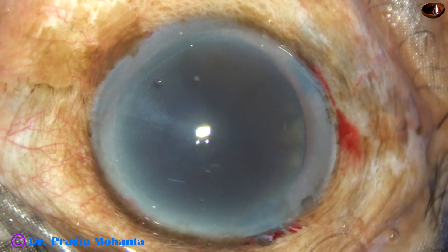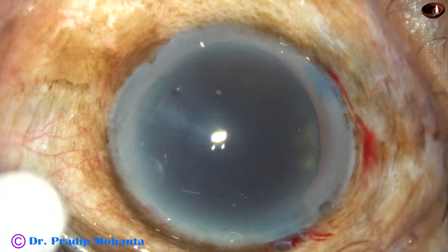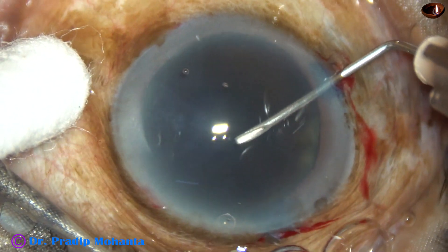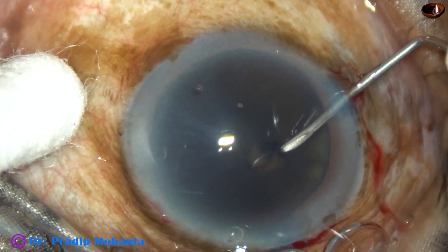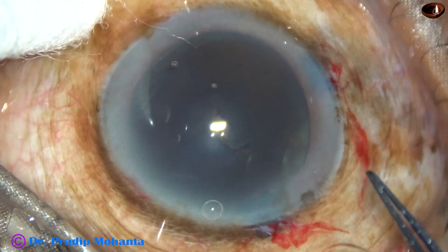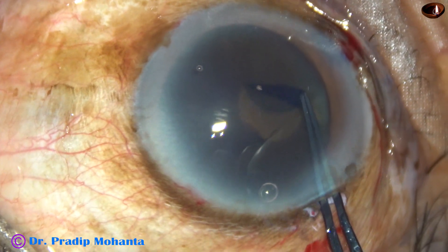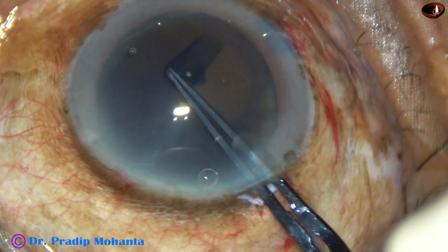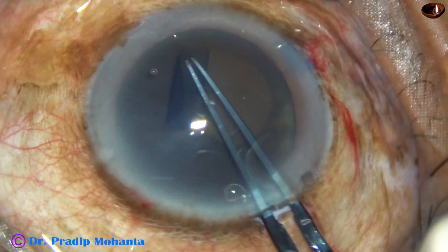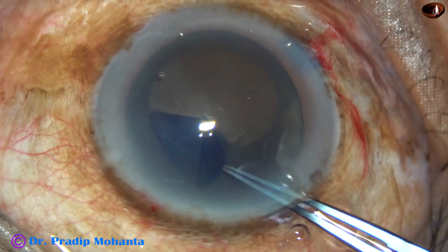And now, it's time to do the capsulorrhexis. We have to do an adequately sized rhexis in this case, so we have to give quality time for this rhexis — we cannot hurry up. A capsular tag has been raised. And now, I take the rhexis forceps, go to the periphery, and guide the capsular tag all around.